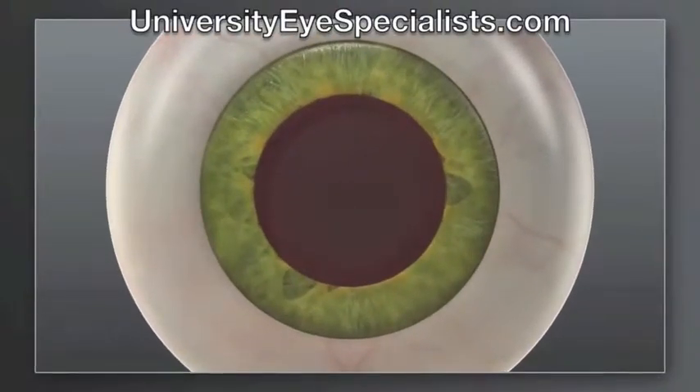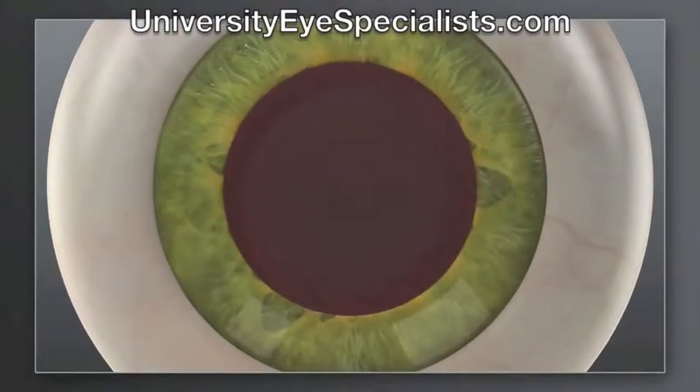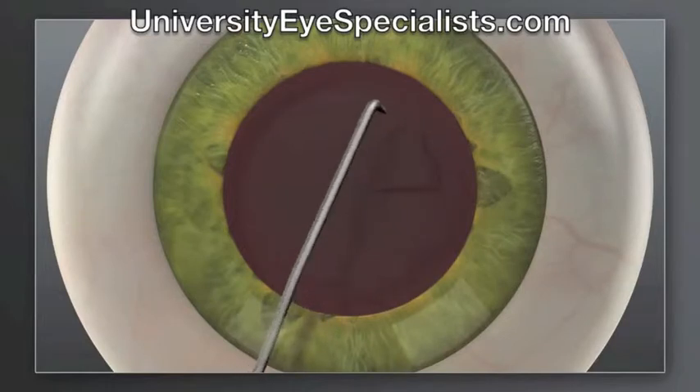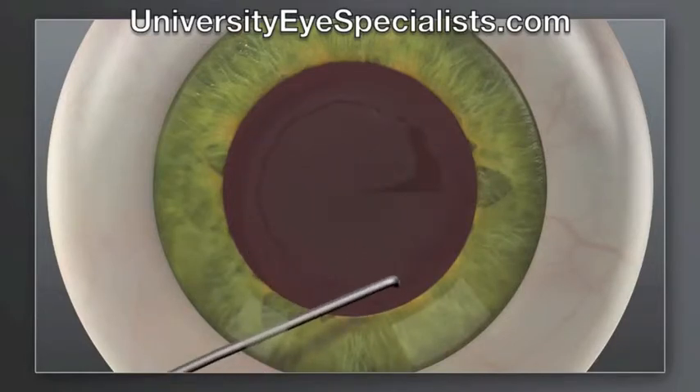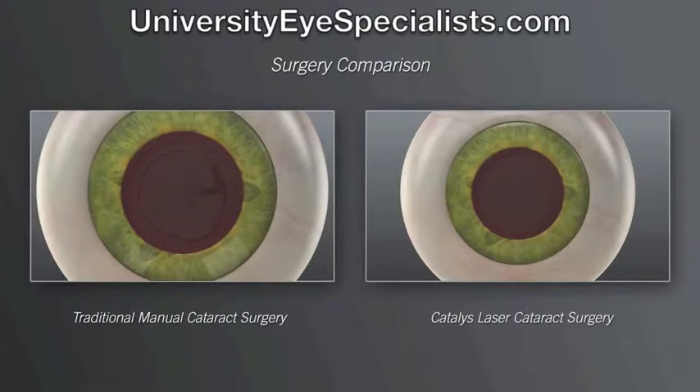How does laser cataract surgery compare to traditional manual surgery? In traditional cataract surgery, we use handheld blades to create incisions in the cornea for accessing your cataract. We then use an instrument to manually create an opening in the lens capsule that holds the cataract. The goal in these steps is to make the corneal incisions precise and the opening in the lens capsule as circular as possible, in the right location and size to fit the replacement implant.